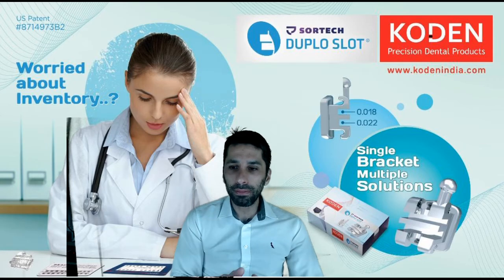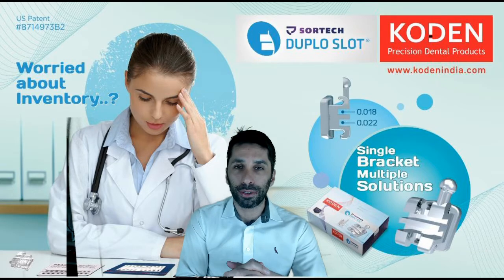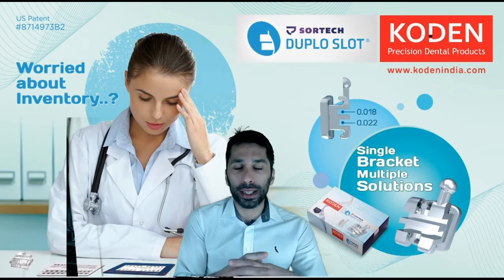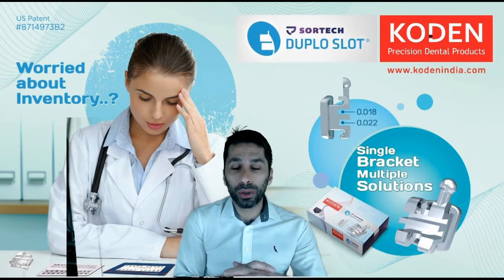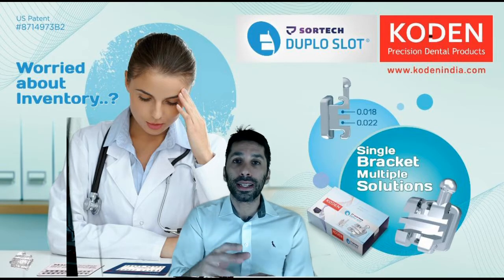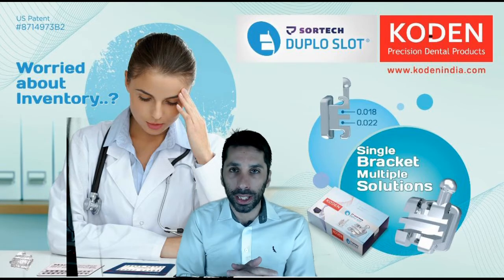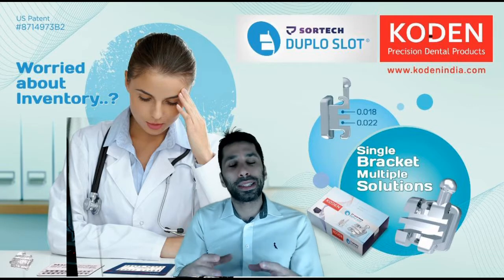Hi guys, Hamid here. The reason I'm here today is because I want to introduce you to this new kind of device that we develop and create here in Brazil. The double slot bracket is one of a kind and unique when it comes to any other brackets in the world, because the double slot bracket, differently to others on the market, has two slots on the center of the piece. This is a huge thing — by using the double slot bracket you can use two arch wires at the same time.